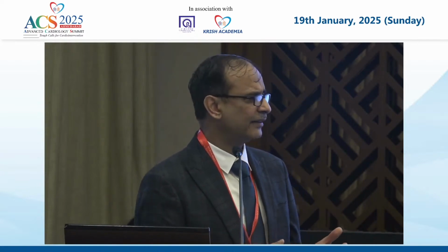As a community, we need to take a call. You'll hear a lot of people who say, no, we should stent it, it's a TCFA, and it's this, and it's that. I think we need to take a call there. Somebody who's 35 and who's running the marathon, who's got a very large and extensive TCFA in the proximal LAD, this patient is going to have a bad outcome regardless of what you do.